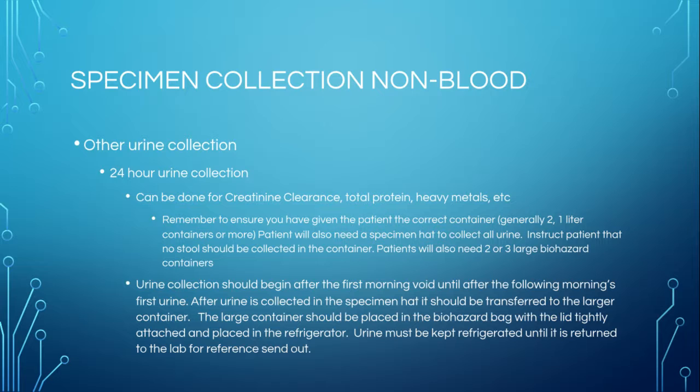24-hour urines always go to a reference lab. It is not something we can do in the facility. We just can't, so that has to be sent out. So I'm going to talk a little bit about 24-hour urine and how to collect any 24-hour urine.